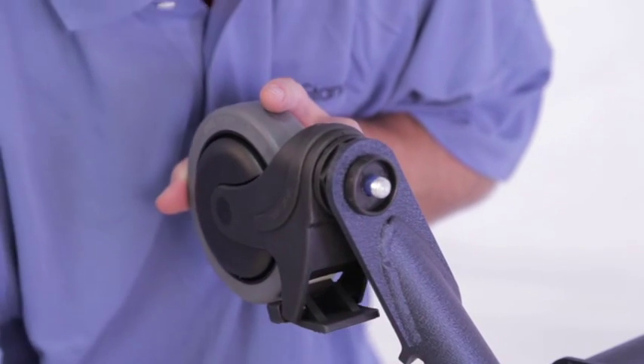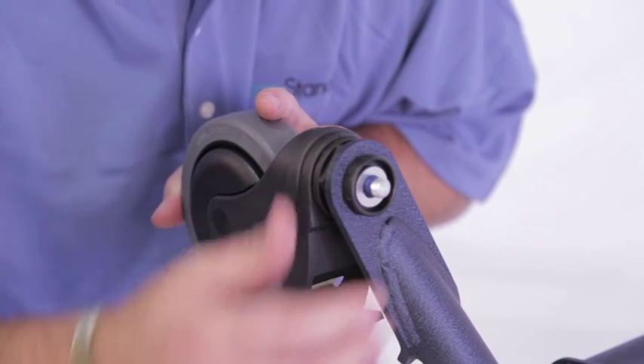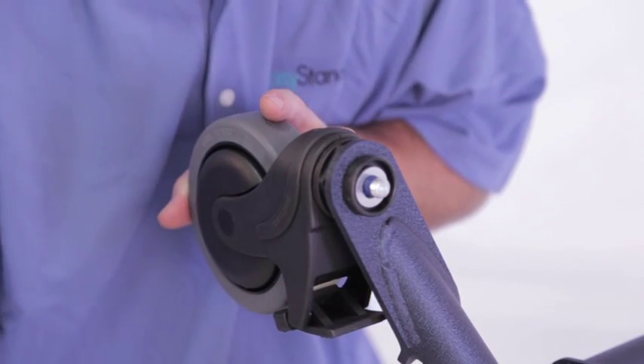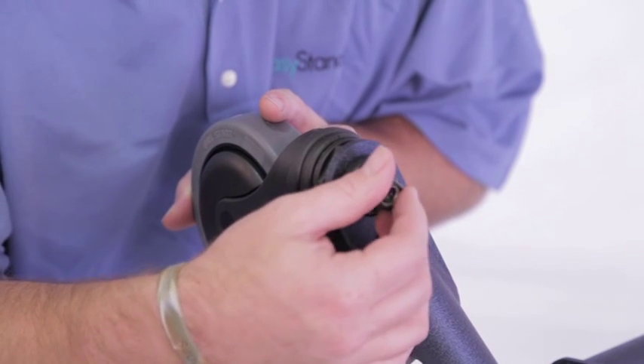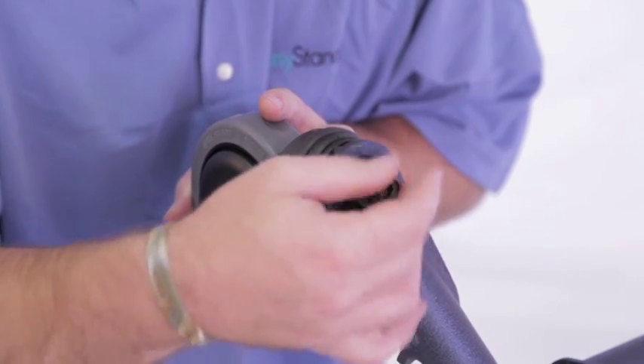Place the black cupped washer onto the caster stud. Place the second metal washer into the black cupped washer on the caster stud. Place the lock nut onto the caster stud and tighten securely using the provided wrench.